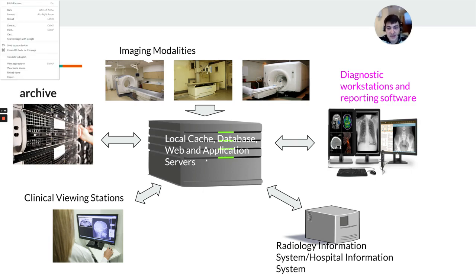Now, I should mention that this is a very typical workflow. There are instances where clinicians would look at images that have not been reported yet. This would be things like tube insertion or maybe emergency workflow. So there are different types of scenarios that exist. Again, this diagram holds, because ultimately what they're going to do is go into their clinical viewer and search for the patient that they need. They're going to open up the images, whether they're reported or not reported. The reported versus not reported piece will just affect whether there is a report for them or not.